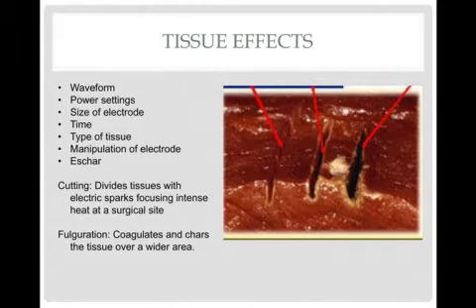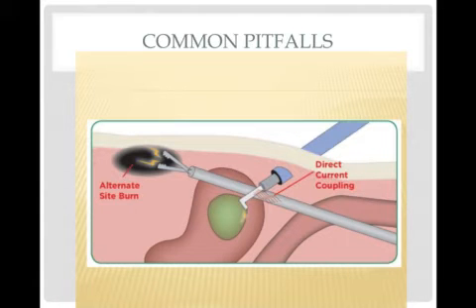Also, if you have an eschar at the end of your diathermy tip, a considerable amount of the energy that you're using will go to that eschar, which means that you will be forced to use greater power, hence risking a bigger thermal damage or tissue effect. That's why it's very important to clean the eschar at the tip of the diathermy.